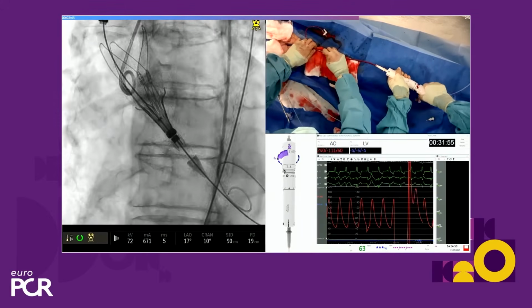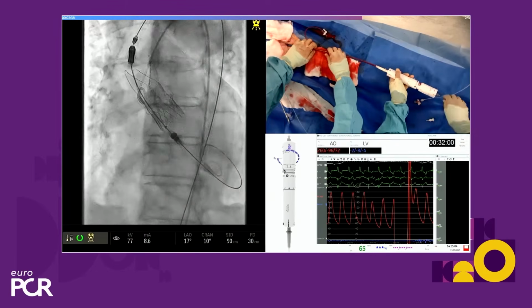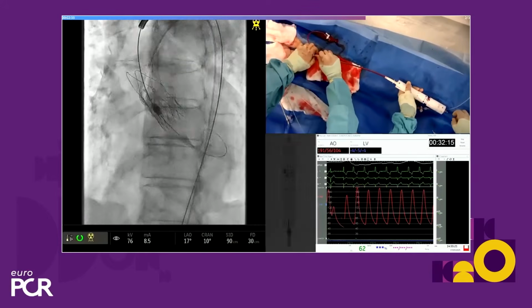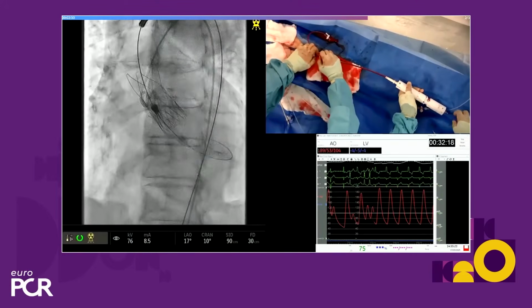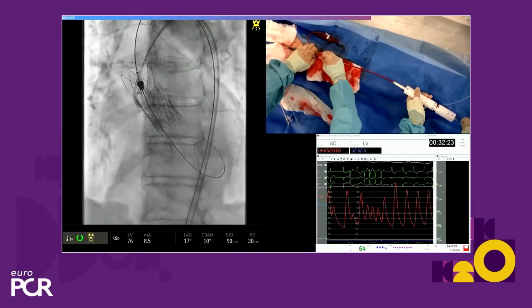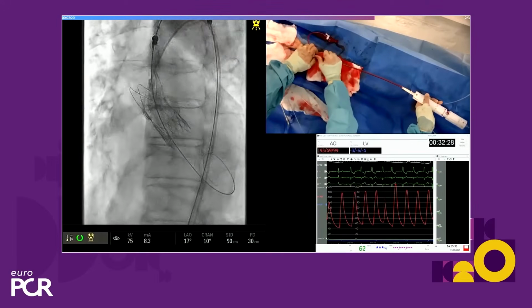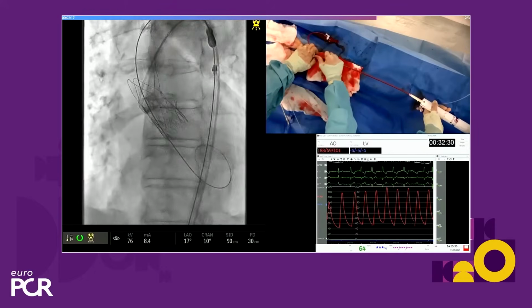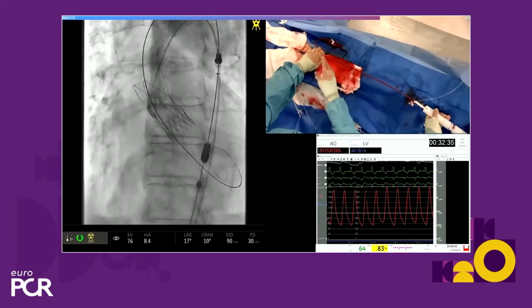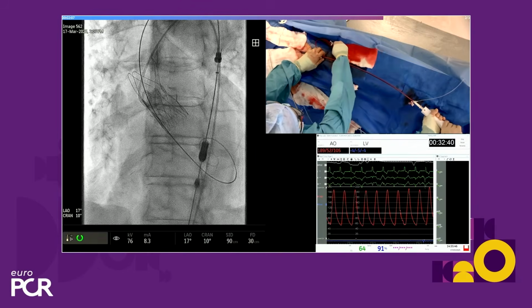As you see there, opens well. And we've had detachment of the delivery catheter. So now it's very important to centralise that wire, and you do that by pulling the wire back so that you don't risk pulling the valve aortic, embolising the valve as you pull back. And you're reversing knob 1 and then knob 2, which you can do under screening. You want to ensure that the delivery catheter comes out all in one.